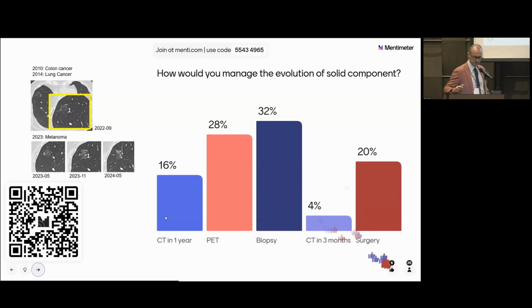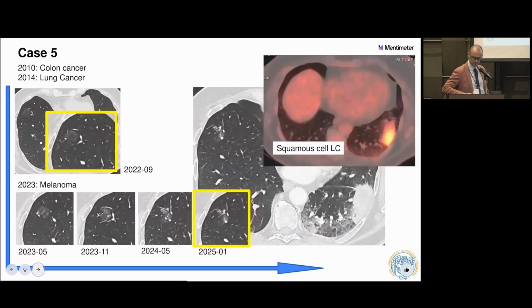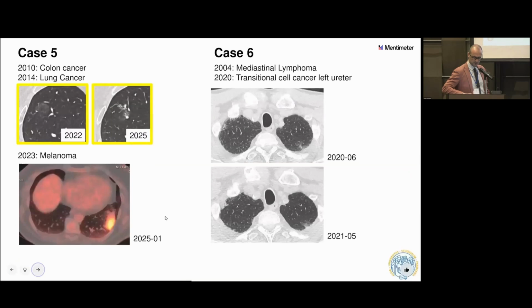So here's what we did, another CT after 6 months, and this is what is happening in this lung. The big mass on the left lower lobe, this is a squamous cell carcinoma with an uptake of around 10. I go by heart. Similar case, we keep them side by side because this is quite important for the non-solid opacity showing up.